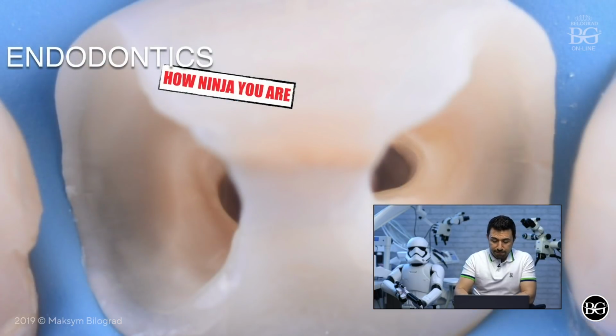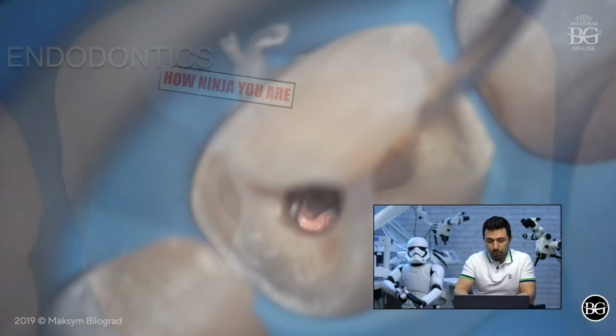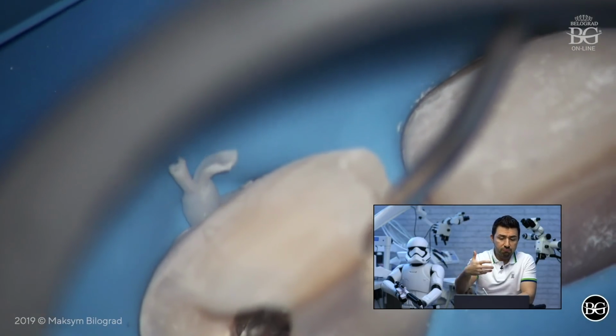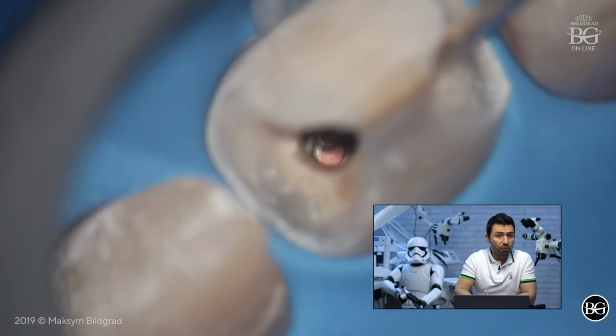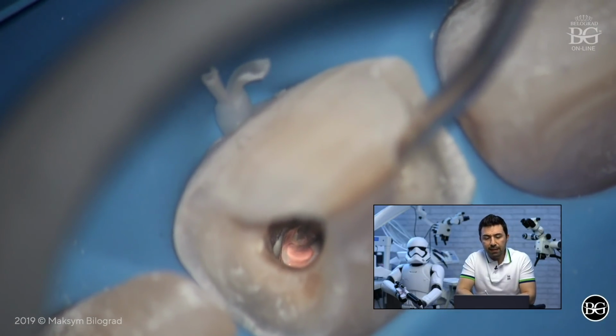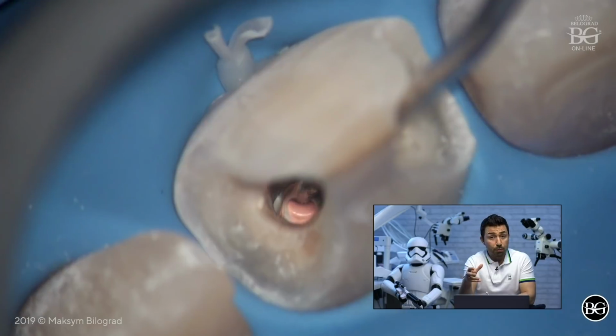The process of obturation was pretty simple also. We put MTA after calcium hydroxide removal. There will be very soon another issue of our BG dental cases.